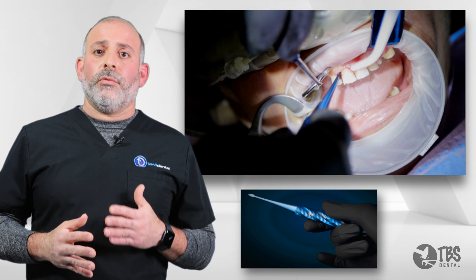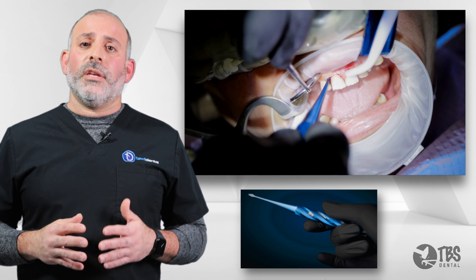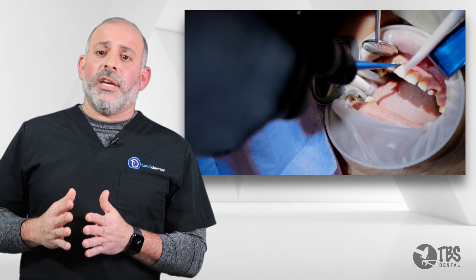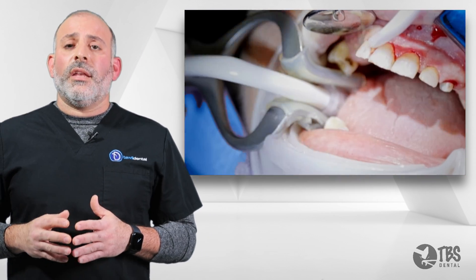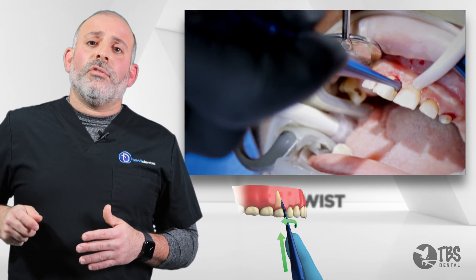You can find one purchase point or two, depending on the mobility of the tooth. If the tooth begins to mobilize from one aspect, we can keep hovering on that same aspect, but often we'll have to go to a second location, maybe mesial or distal to that site, and go to the pencil-grip and then into the palm grip and begin to push and twist apically.